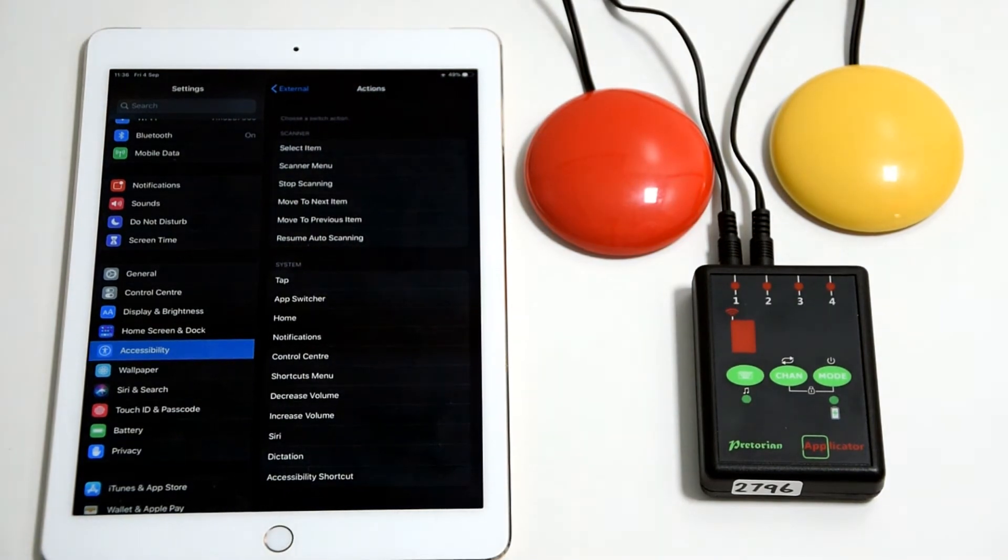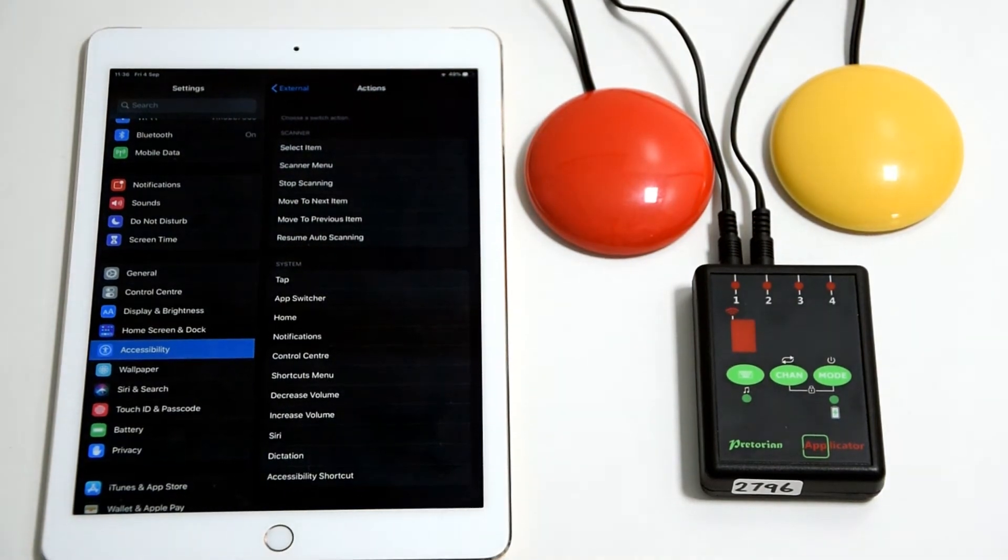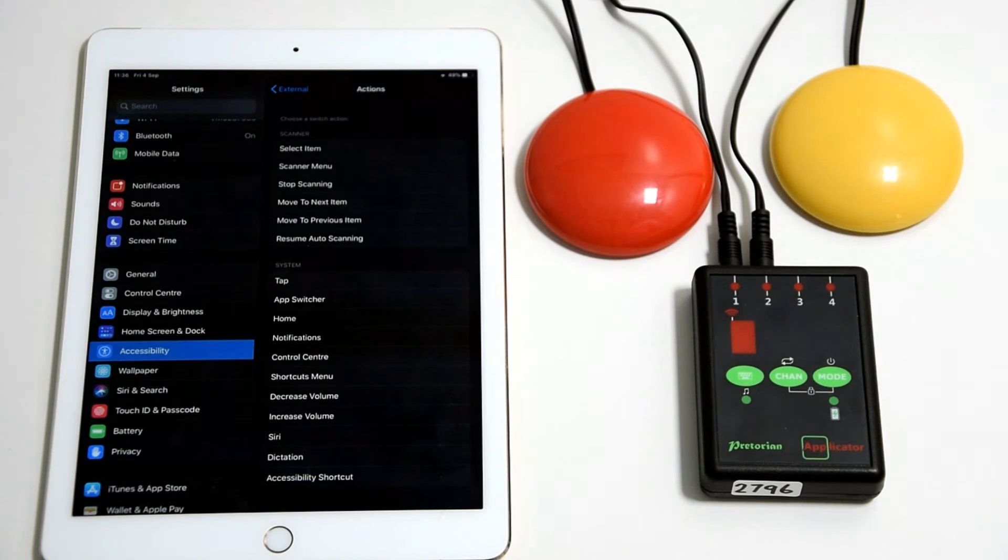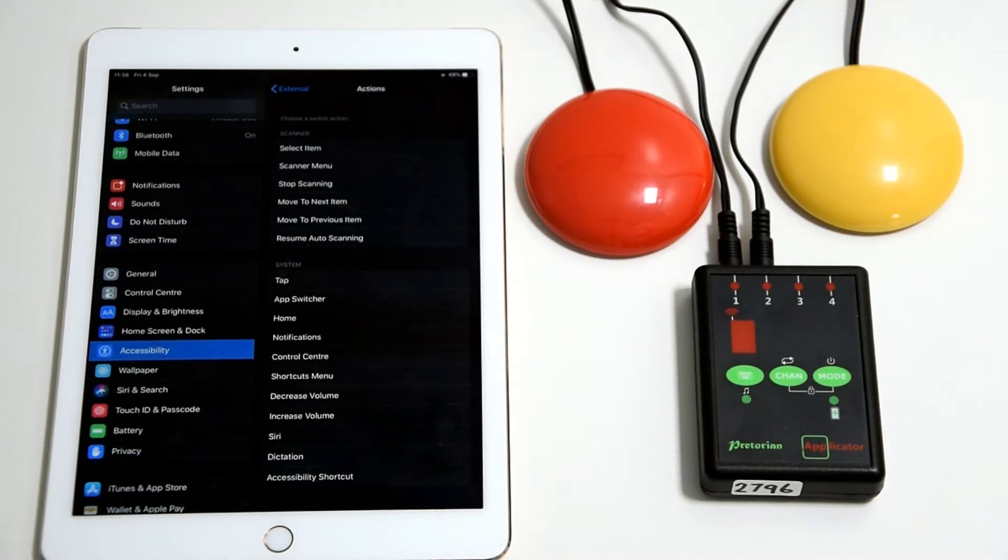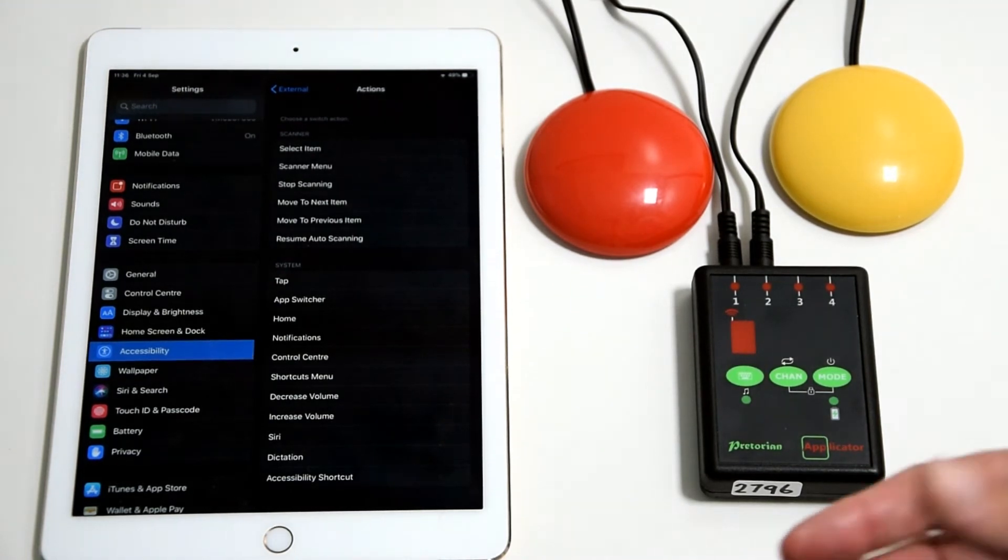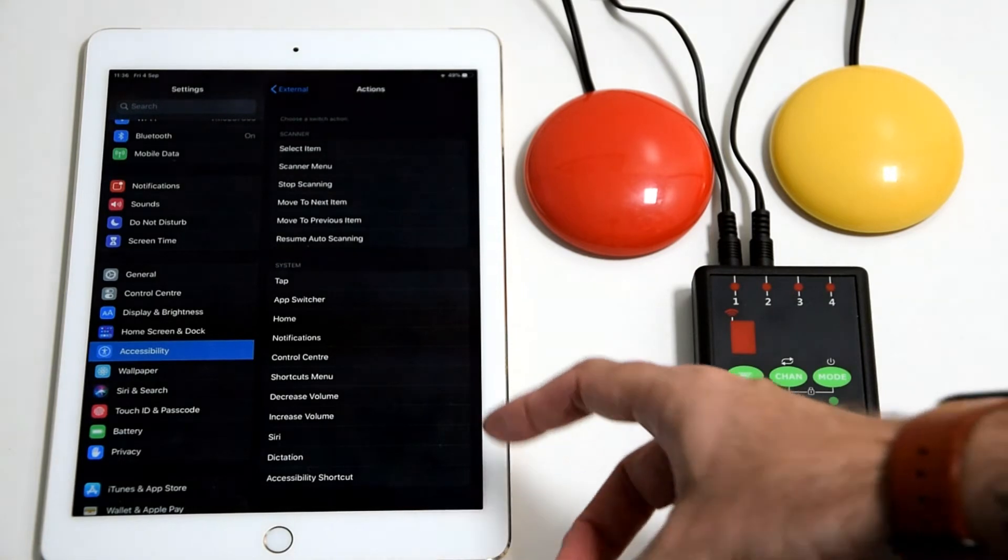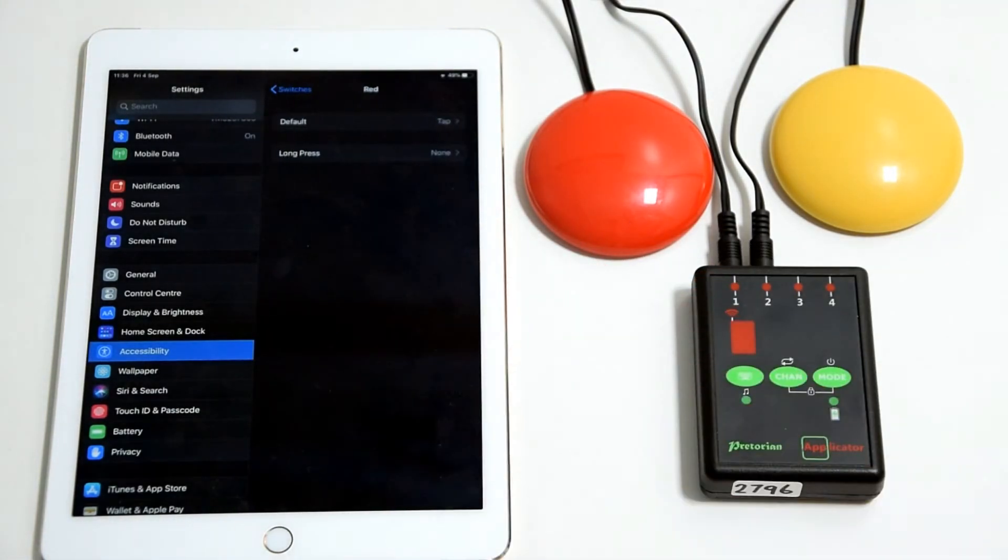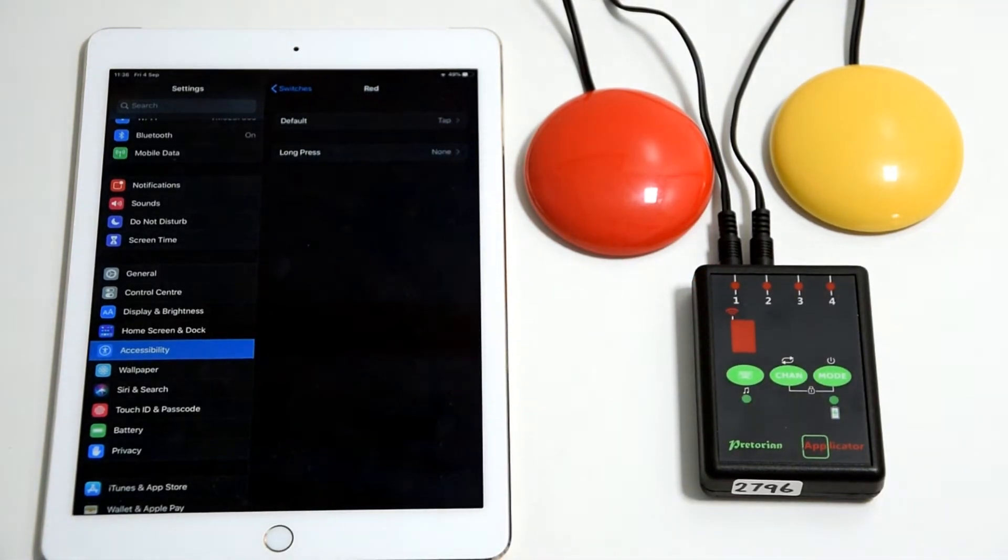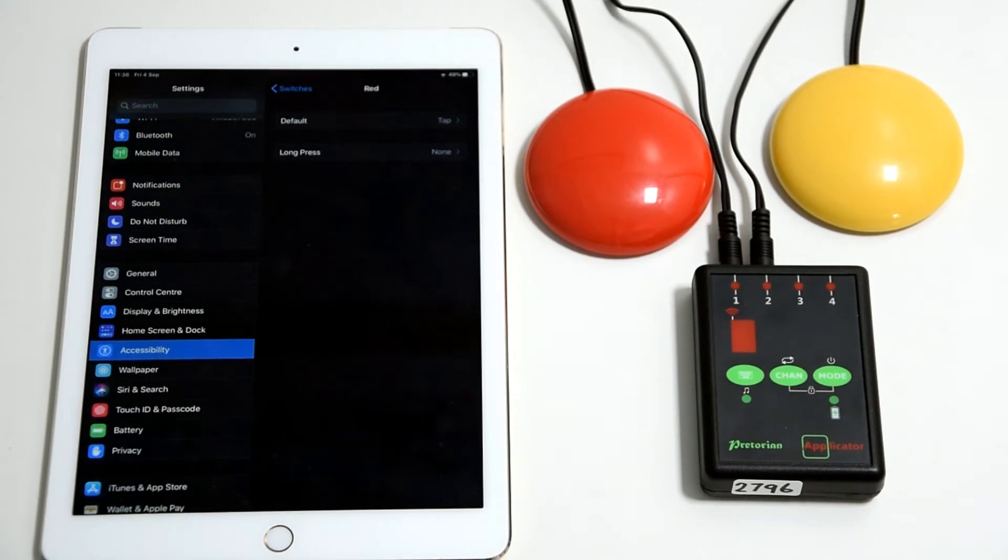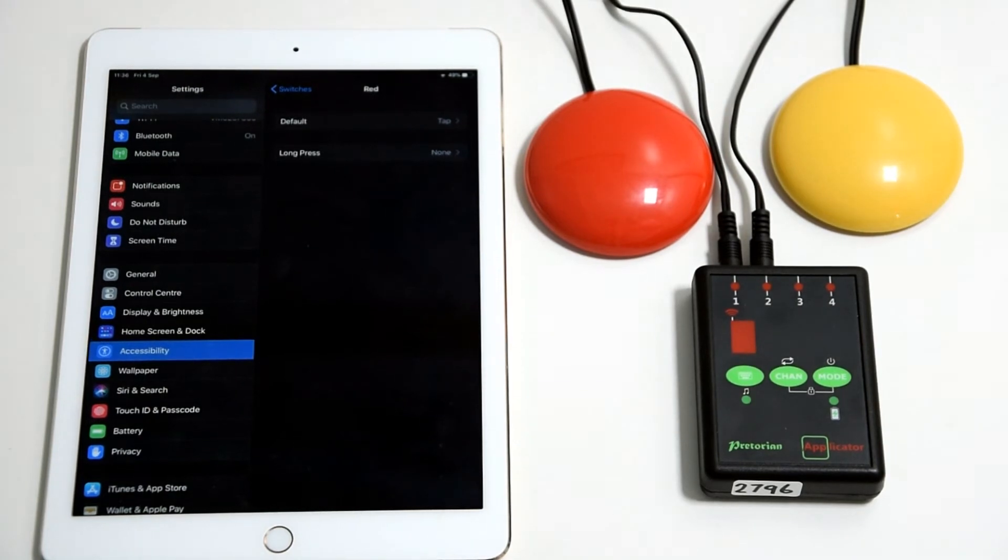At this stage you get a list of actions and you've got lots of different options within the iOS menu. We've obviously set it up as home and enter in the mode section, so it would be prudent to put it as something such as tap or select item, because that's what you would do with your finger most often. In this instance we'll just use that one.